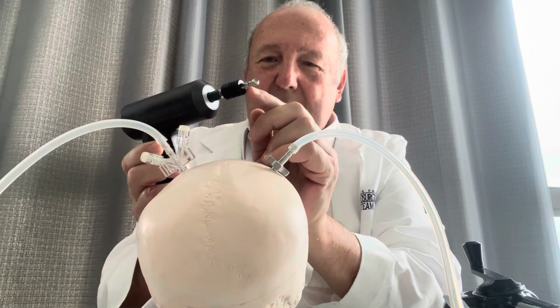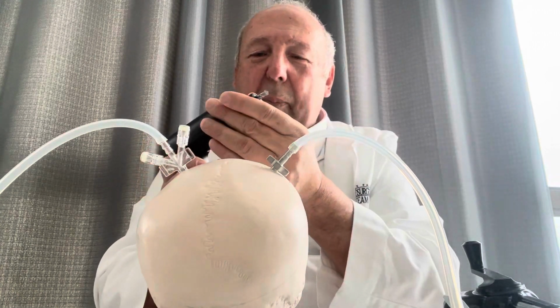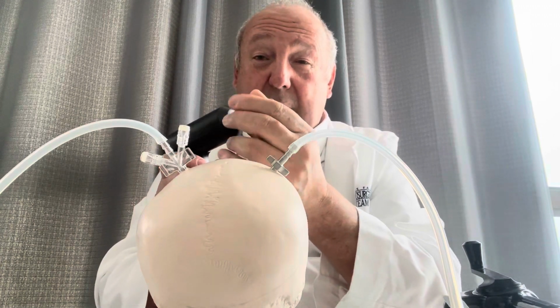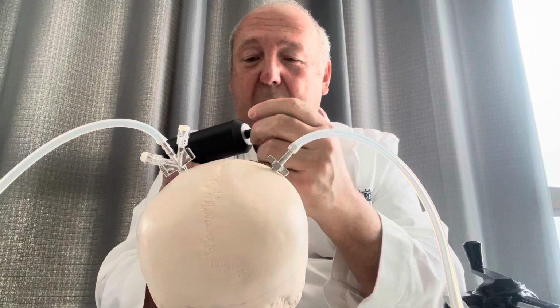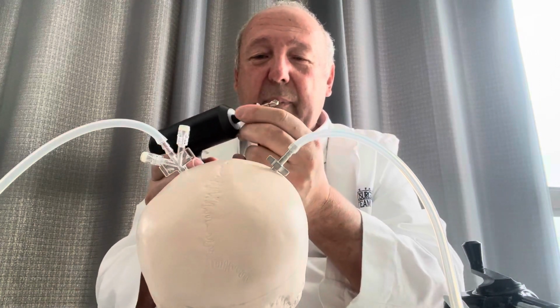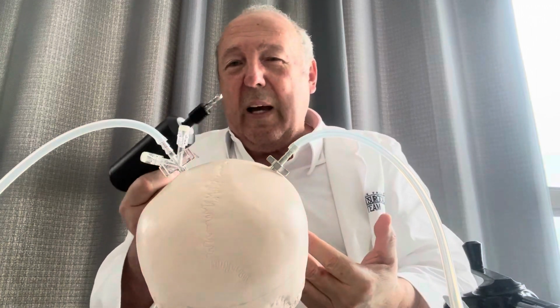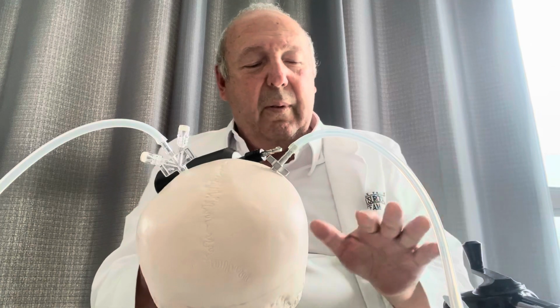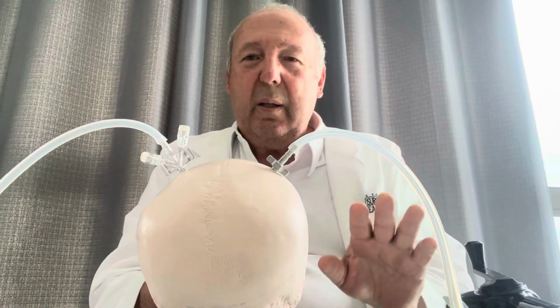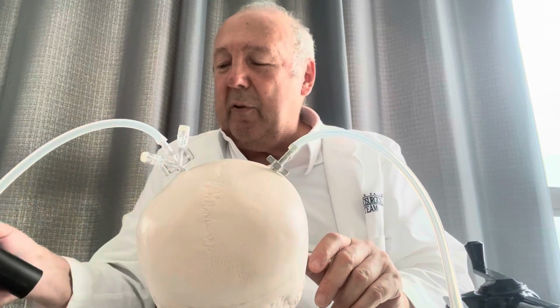The drill bit has measurements in centimeters. The stopper is built in. All you have to do is rotate it to the desired position. So it's faster, and you don't have to use a ruler, little screws, and so it's more effective and faster.